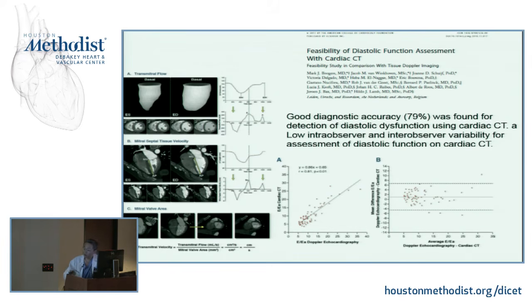Since we have good spatial resolution, and if you have a patient with a slow heart rate and reasonable temporal resolution, you can calculate how much the annulus is shortened by measuring the axis of the left ventricle during systole and diastole. The difference would be the excursion of the mitral annulus. And you can trace the mitral valve area. With that, technically you can have mitral annular velocity.